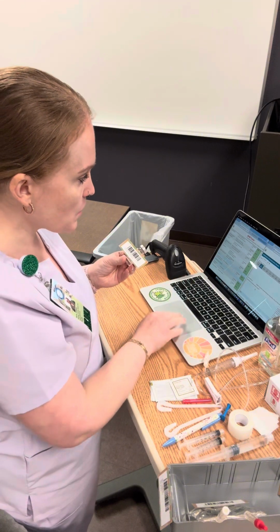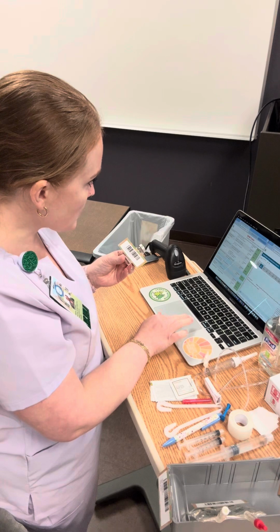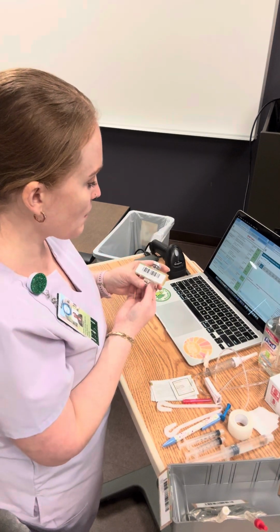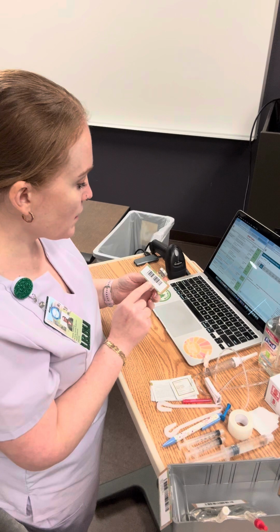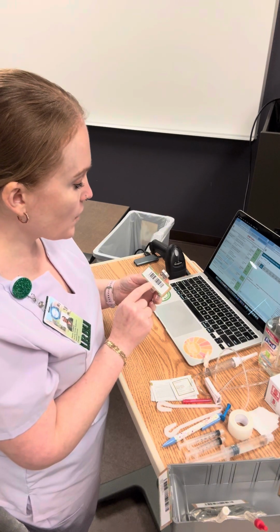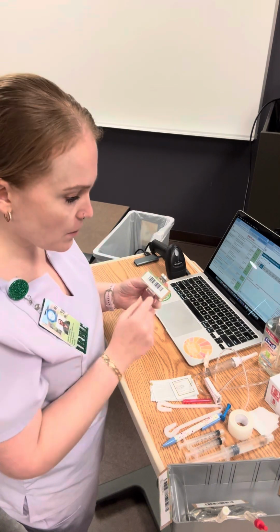And so now we're going to see what time this is due. On my orders, it says that it is due at 7:14. And on my MAR, it says that it's due at 7:14. And I'm going to look at my watch here, which says 7:14. Looking at my medication vial here, it says 2 milligrams per mil. So if I'm going to be giving 4, I'm just going to double this and I'm going to be giving 2 milliliters. I did that math in my head.